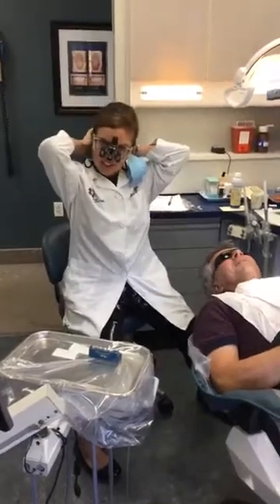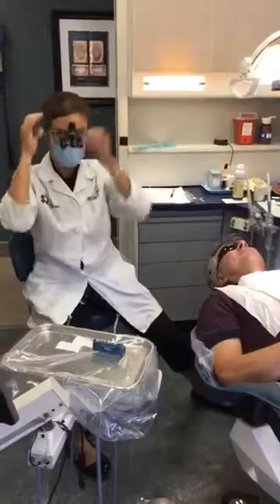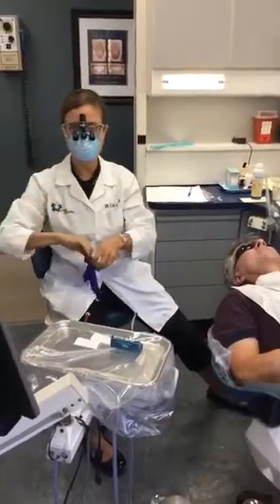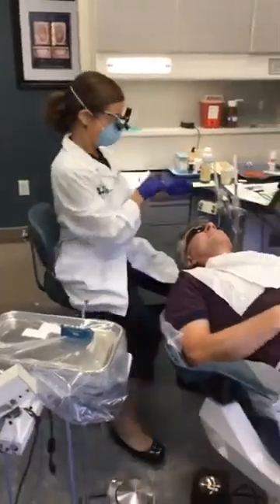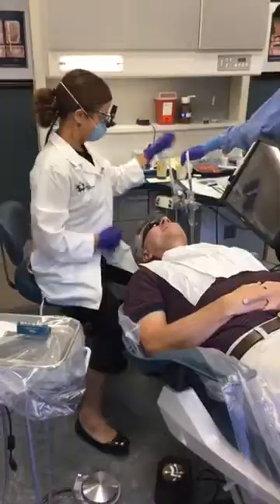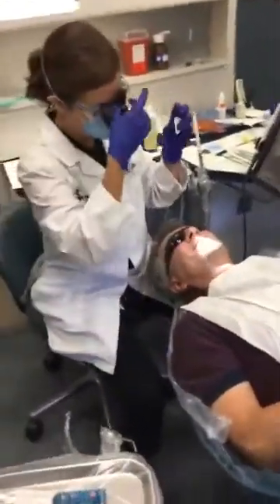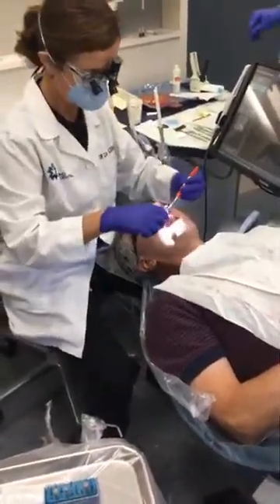He's scanning for a crown on the lower right. We've already got everything ready, so now we just have to take the digital image that is going to go to the laboratory so they can make the beautiful all-ceramic crown. Thanks for being such a pal, Stephen. First thing, we're going to put this in next to Stephen's tongue — just keep his tongue out of the way.